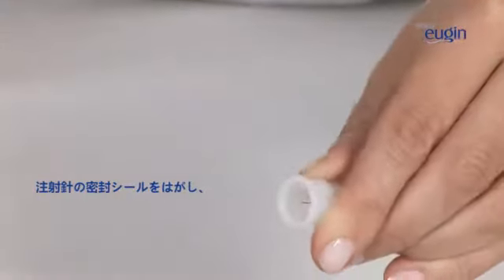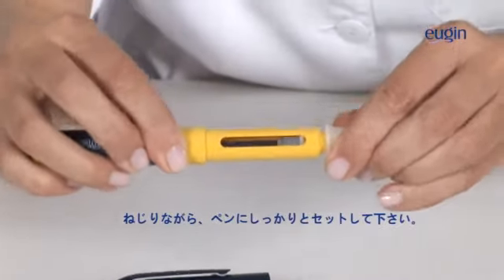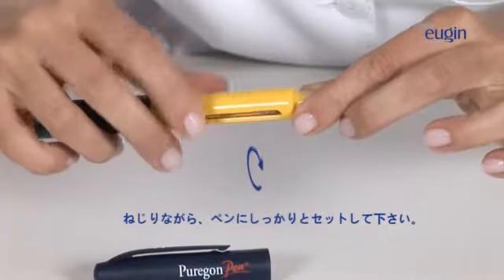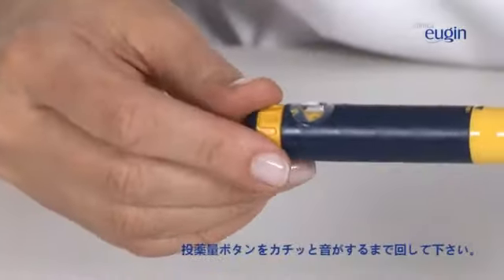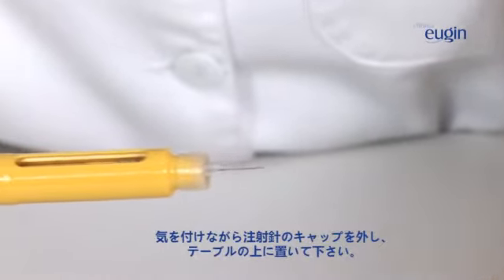Now, take a needle and remove the paper wrapping. Screw it tightly to the pen. Dial the dosage button until you hear a click. Carefully remove the needle cap and leave it on the table.